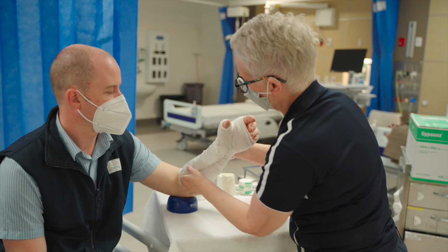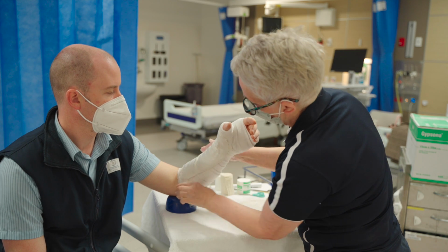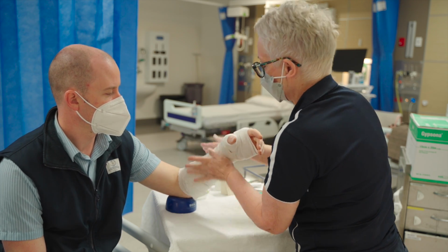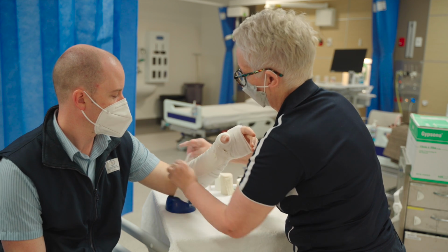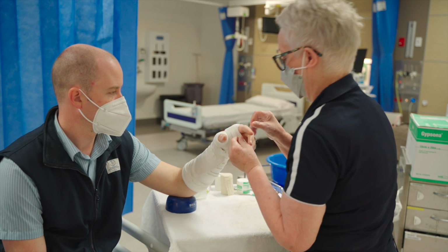Just keeping an eye on the position at all times, making sure that you haven't lost position. Keep your fingers out of this. Take a few minutes to just smooth it down with your hand, not too long, because it will be crack set in 3 to 5 minutes.